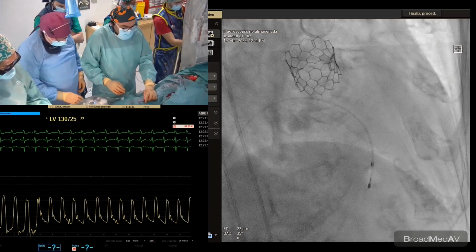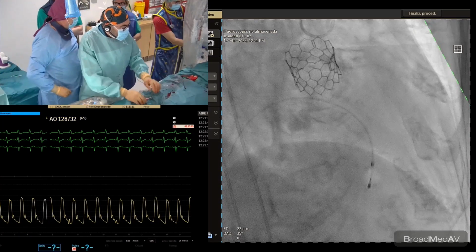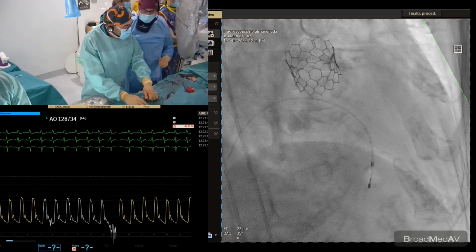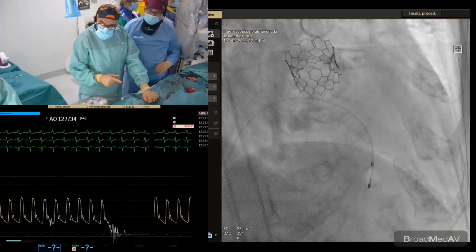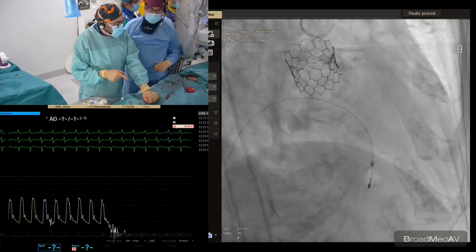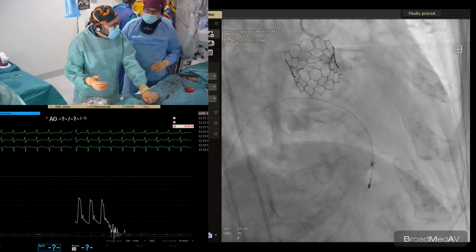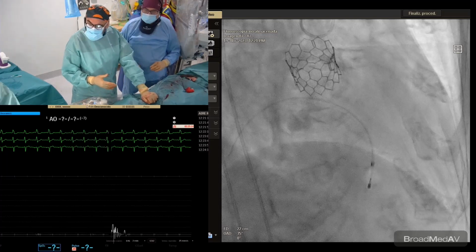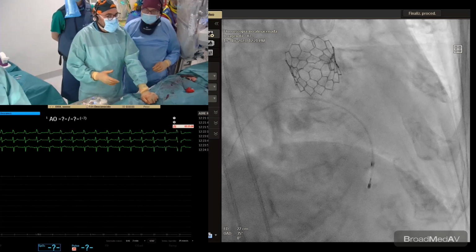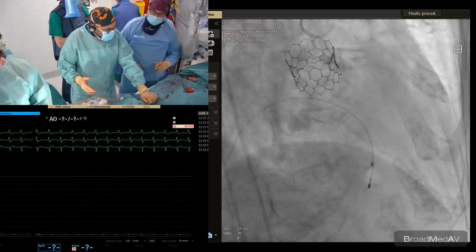What we are going to do now is what sometimes is the most difficult part of the procedure, that is to close the artery. It is not needed to use the dilator to retrieve the sheath. What we are going to do now is to interchange by a wire. Sometimes we use the 35 wire, but we like to use an extra-stiff wire to implant the MANTA, because we had some problems in some patients with a conventional 35 wire.